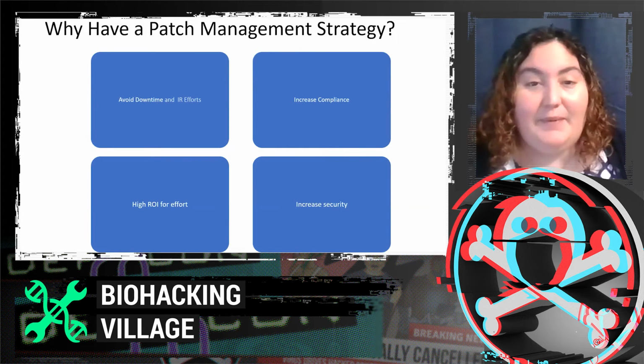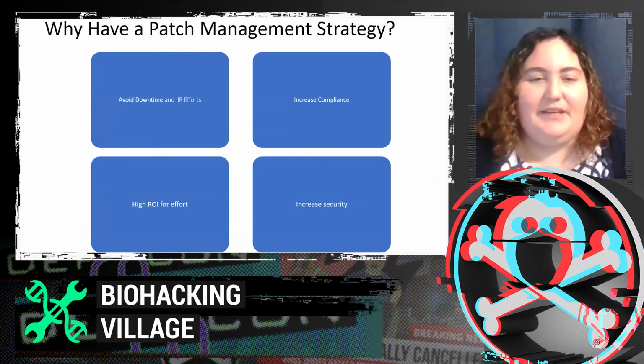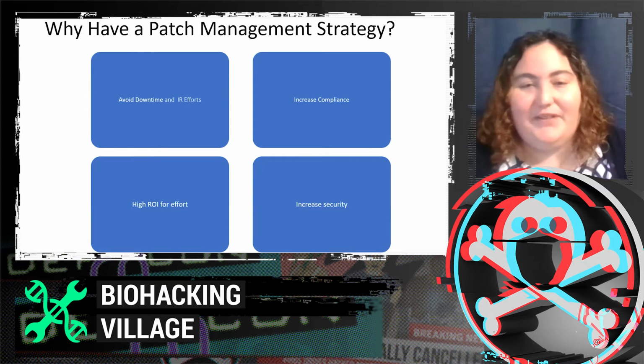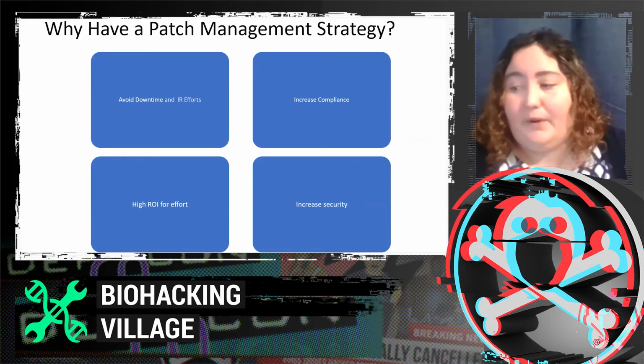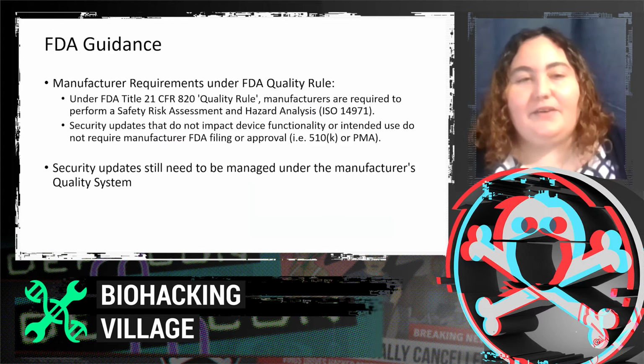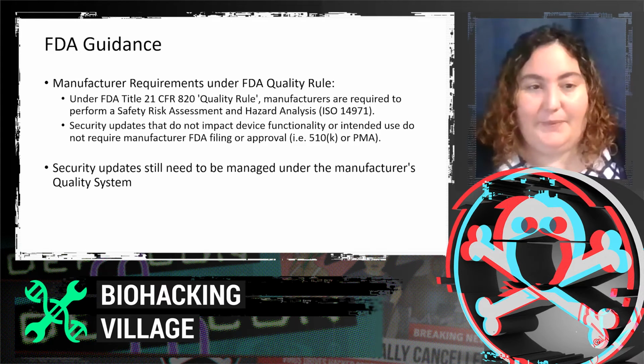Why have a patch management strategy? It avoids downtime and response efforts. It increases compliance. There's high return on investment for the effort, and ultimately increases the security posture of your organization. There's also some FDA guidance you might want to look up on the topics.